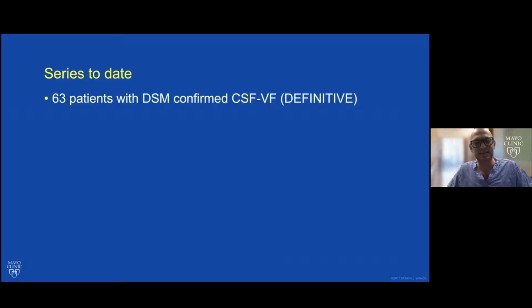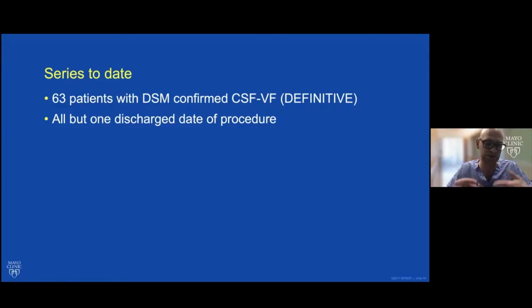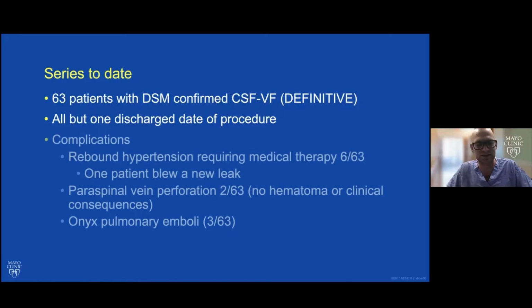Our series to date, so this is looking at patients who've had DSM done at Mayo with a definite CSF-venous fistula that was determined by the neuroradiologist performing the DSM. So these are definitive, not some of the questionable ones. And we have treated several patients with questionable fistulas with this technique. All but one patient was discharged the day of the procedure. One patient just had some nausea and vomiting, probably related to a combination of rebound hypertension and the effects of sedation medicine.